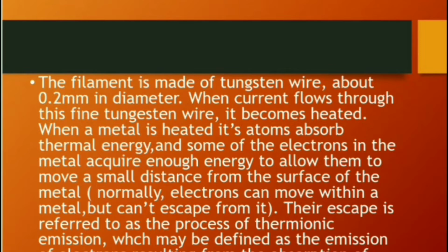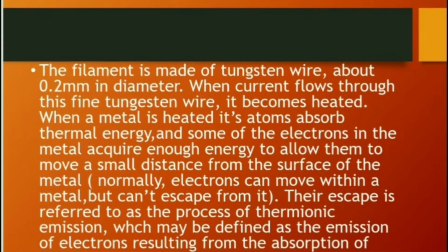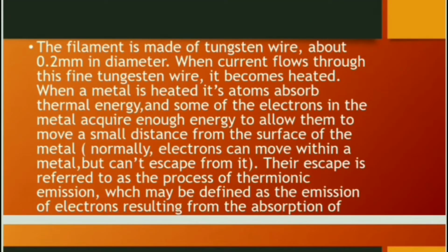And a metallic focusing cup. The metallic focusing cup is also a part of the X-ray tube which will be discussed later on. Now, the quantity of X-rays produced is totally dependent upon the number of electrons that flow from the filament to the target anode of the tube. Noted here. The X-ray tube current is measured in milliamperes. And what is a milliampere? A milliampere refers to the number of electrons flowing per second from the filament to the target.